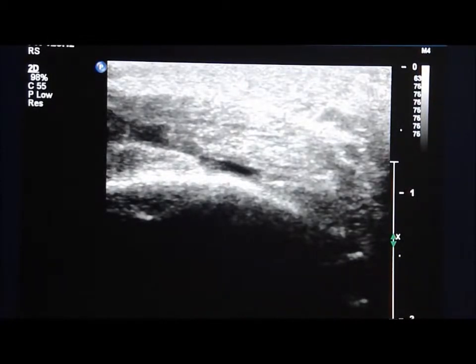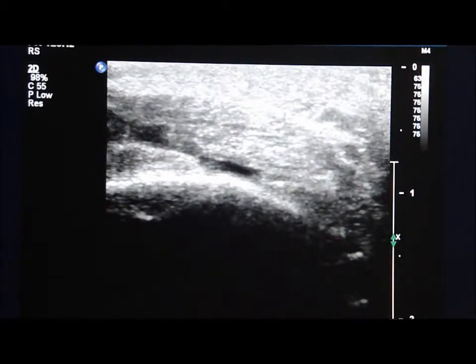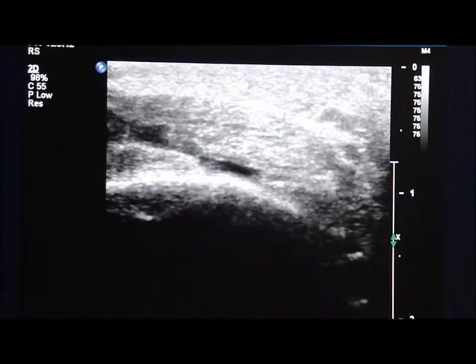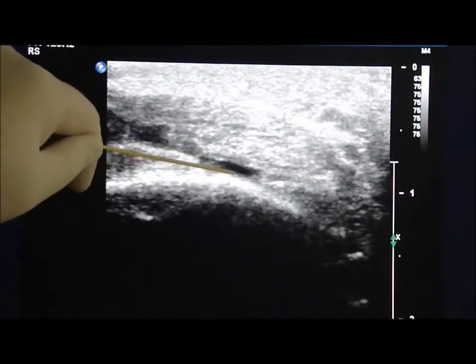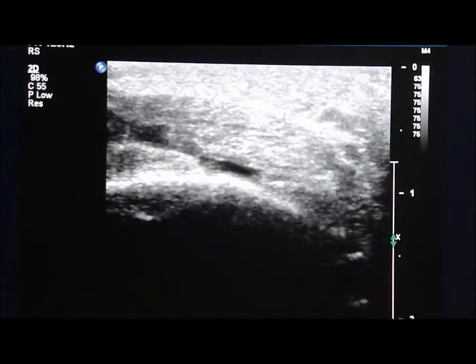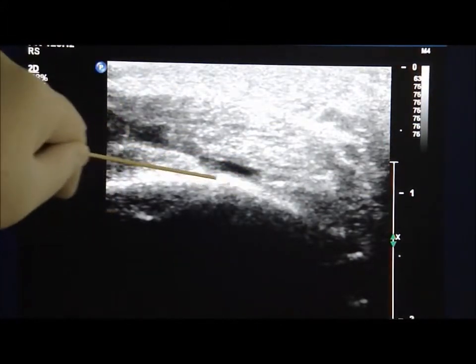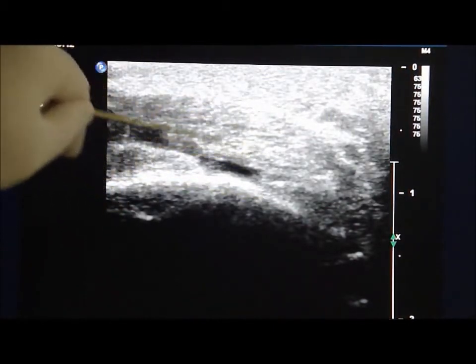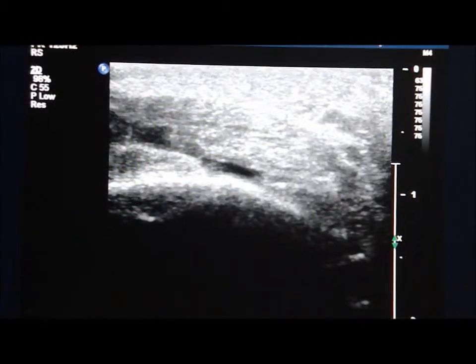After turning the transducer by 90 degrees, the transverse sonographic view of the retrocalcuneal bursa can be observed. As you can see here, this is the enlarged bursa situated between the calcaneus and the Achilles tendon.